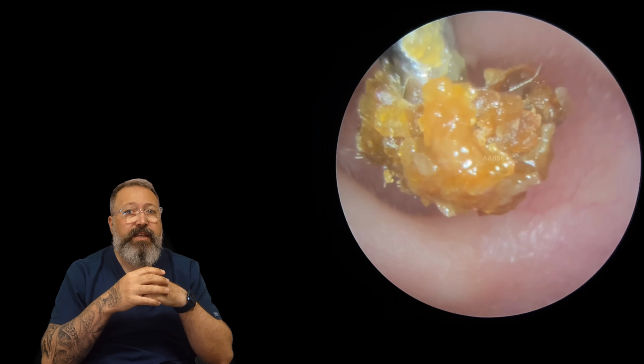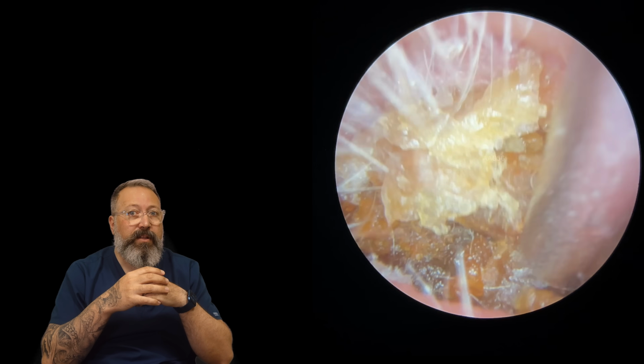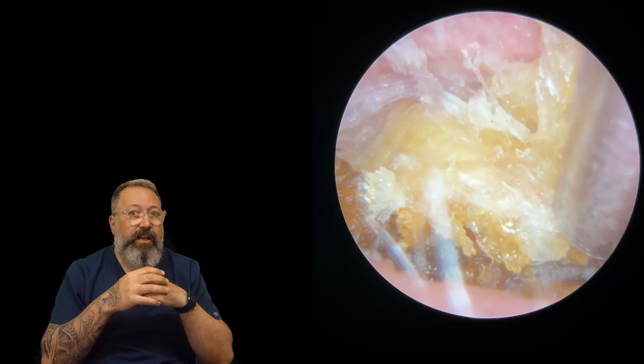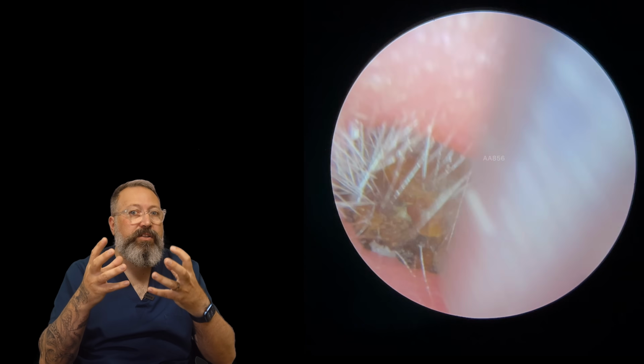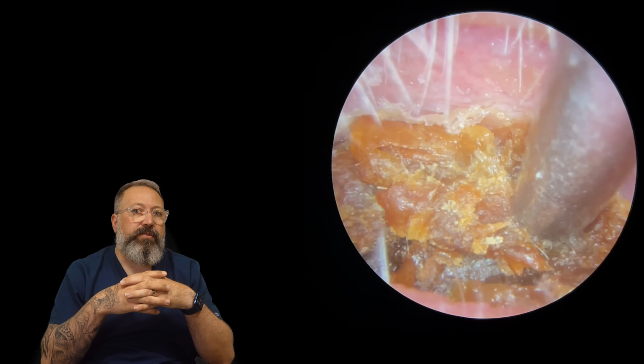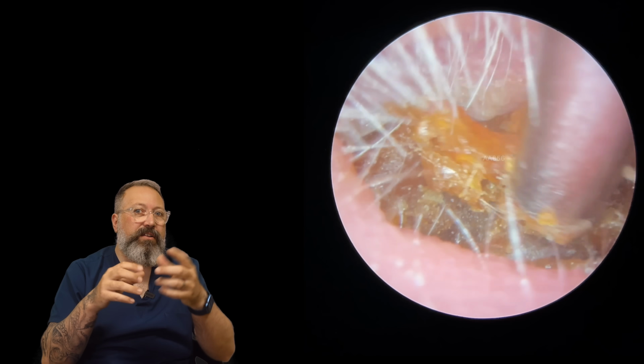There you go. You can see it's really starting to come apart now. It's really loosening up a little bit. So let's get this next section. Now there's the keratin. You can see we're wrapping this, enclosing this wax in just around the surface there. Now there is a little bit of keratin further in. You can start to see that now.